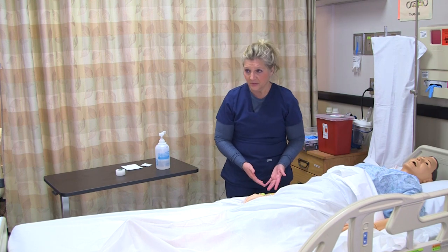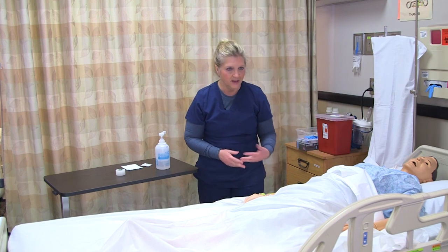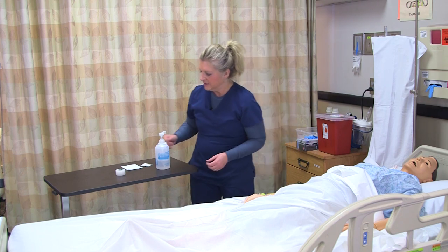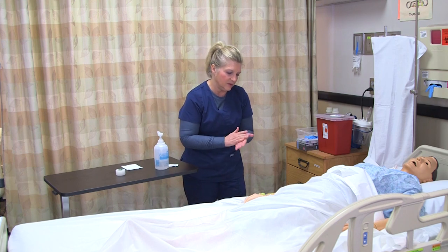It's important to note your assessment of the IV site so that you can document that prior to removing it. This site looks good — no swelling, no redness, no drainage, and the dressing is intact. Now I'm going to go ahead and wash my hands and put gloves on.